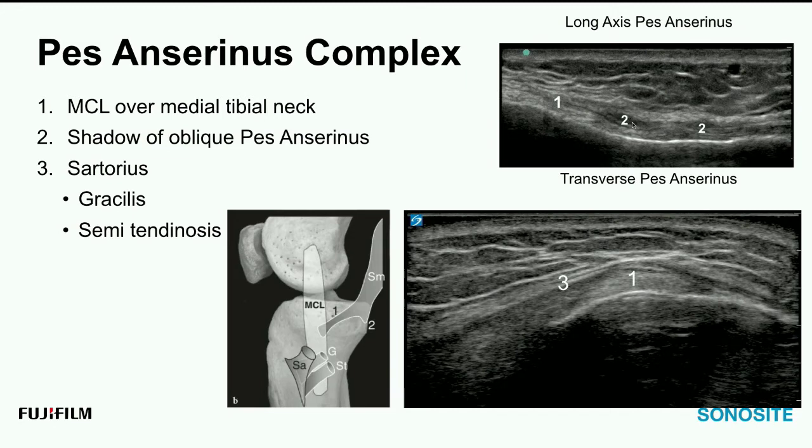These are not pes bursa, and it's sonographically very rare to see a real pes anserine bursitis. You really only catch them a couple of times a year, even if you're scanning a lot of knees. You might only see one true pes anserine bursa over a period of 5 years. They're just sonographically extremely rare, so don't get disappointed. But what you're going to find a lot of is tendinopathy.